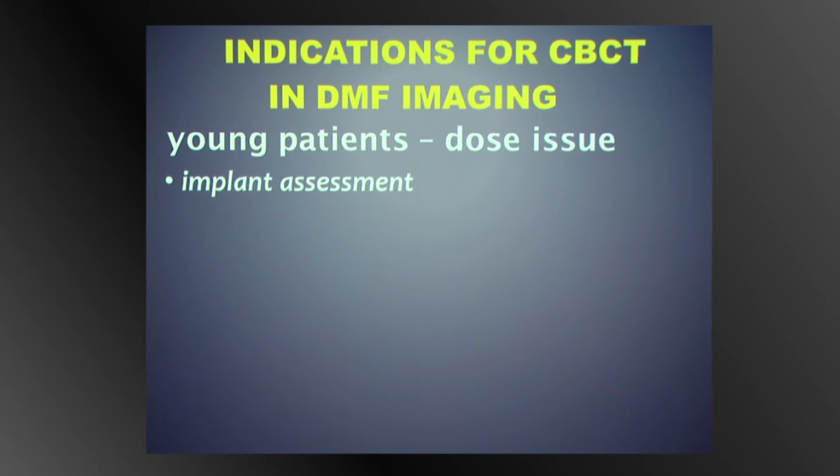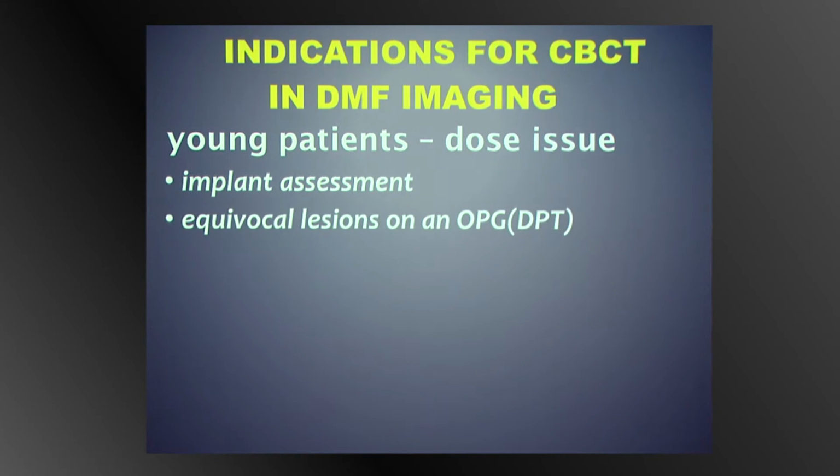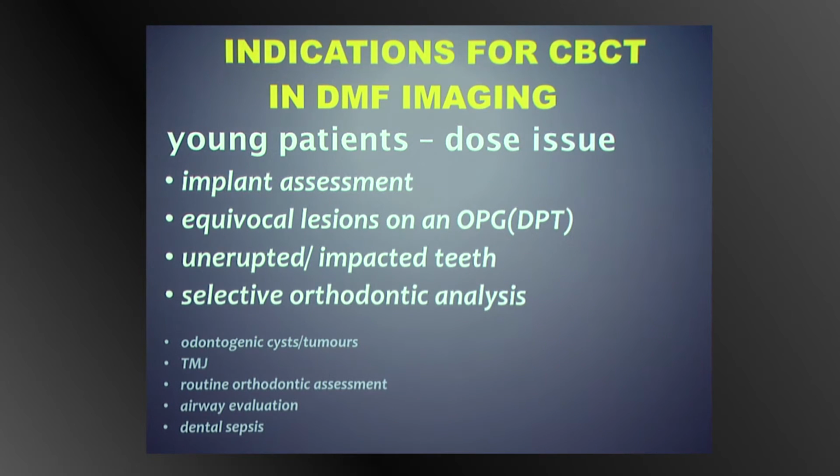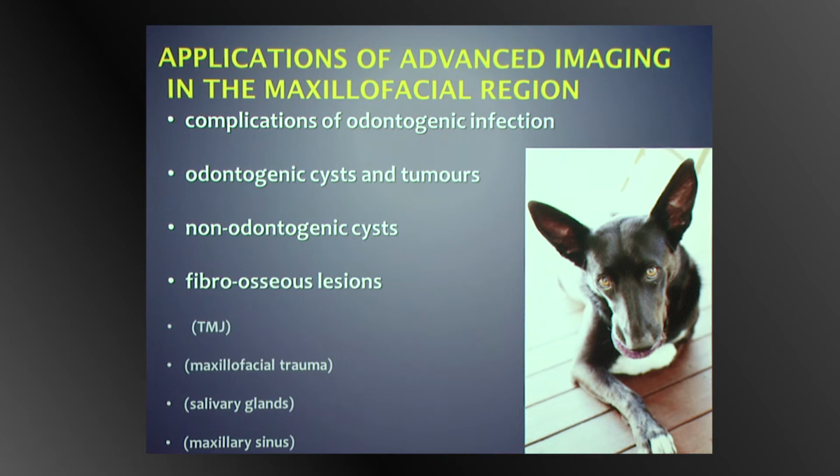It's the best means, it's better than CT. We use it for equivocal lesions on an OPG or a DPT, unerupted or impacted teeth, selective orthodontic analysis and not routine orthodontic assessment. And these are some of the grey, or in this case pale blue areas: odontogenic cysts and tumours, TMJ, routine orthodontic assessment, airway evaluation and dental sepsis. I personally don't use it for any of those. And there's good reasons why.